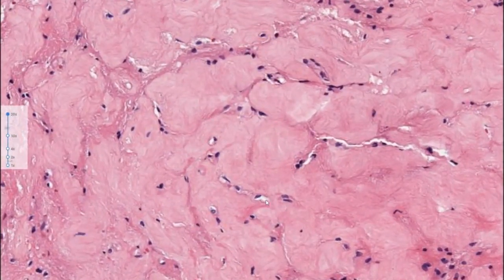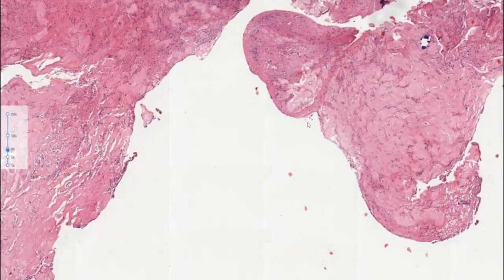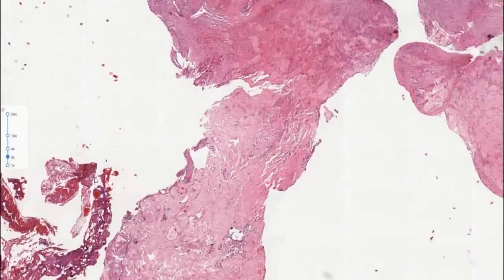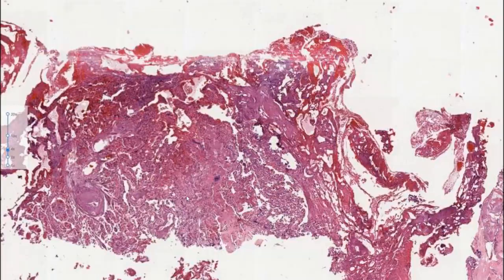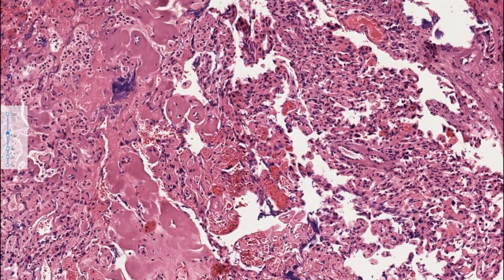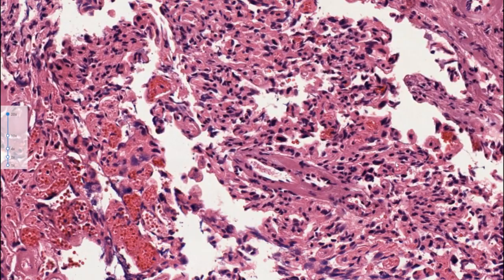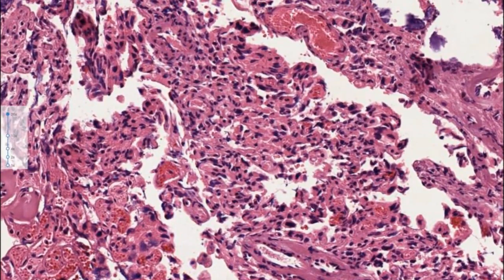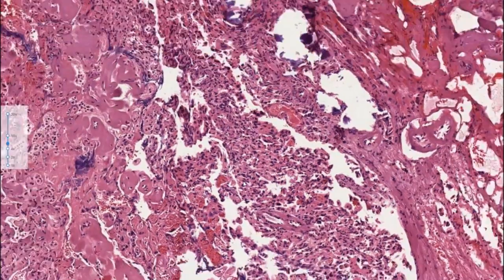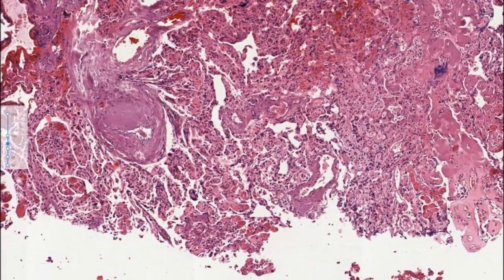There are a few epithelial strands here. So you may have a bit of involvement, but really the lesion is here. And since it's in a ventricle, the main thing that you have to consider is whether this is really just choroid plexus next to another tumor. But the atypia in these papillary areas is a bit more accentuated than you would expect for a normal choroid plexus.